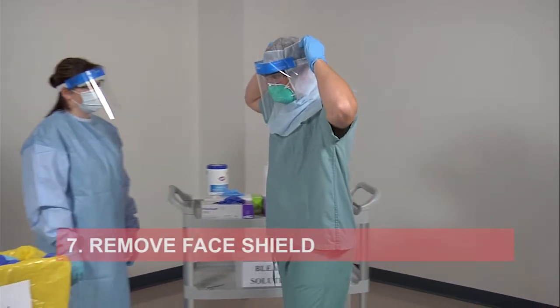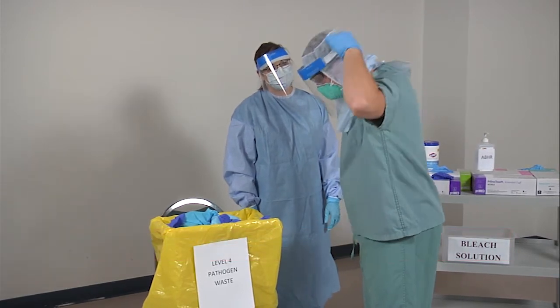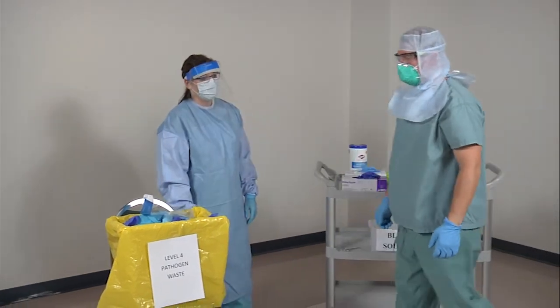Remove your face shield by grasping the elastic at the back of your head or near your ears. Lean forward. Carefully pull up and away from your face and place the face shield in the waste bin.